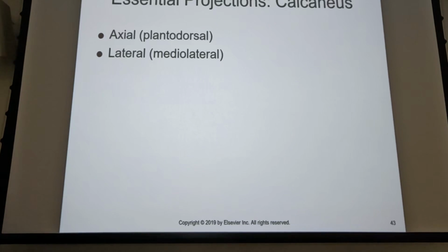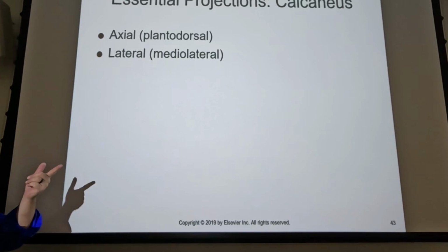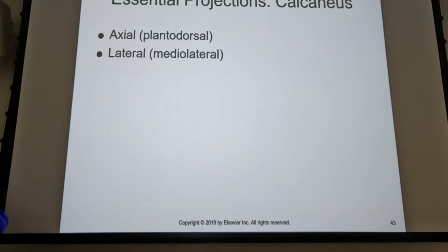And depending on how severe the fracture is, it may be diagnostic that if they can do that, it's not broken, right? If they can get to 90 degrees, it may not be broken. Maybe, but it may not be broken. So your patient is going to have a hard time dorsiflexing the foot to 90 degrees. But if they can, then what we're going to do is dorsiflex the foot until the sole of the foot is forming a 90 degree angle with the image receptor.